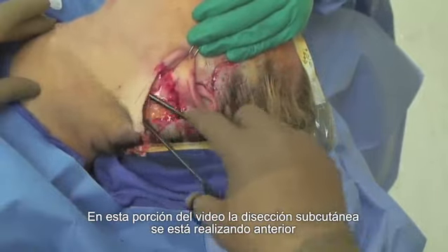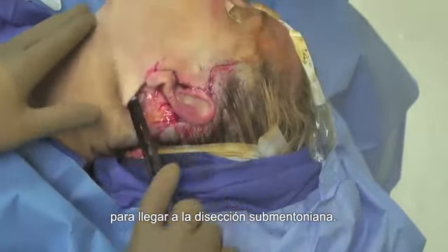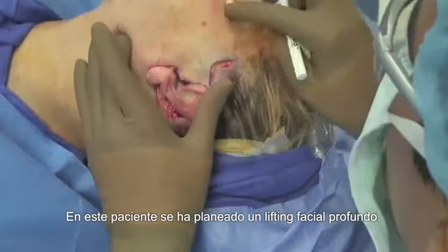In this portion of video that's been sped up, the subcutaneous dissection is carried out anteriorly to rejoin the submental subcutaneous dissection. In this patient, a deep plane facelift is planned.